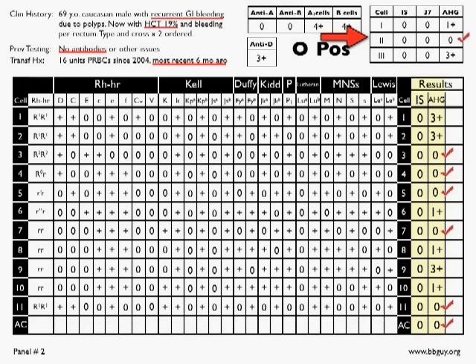If you notice, the antibody screen uses immediate spin, 37, and AHG phases, while the results only show immediate spin and AHG. This could happen for a variety of reasons. It could be that the laboratory has decided that, despite doing 37-degree reads, it's not that important for the antibody panel. That would be uncommon, but it certainly could happen.